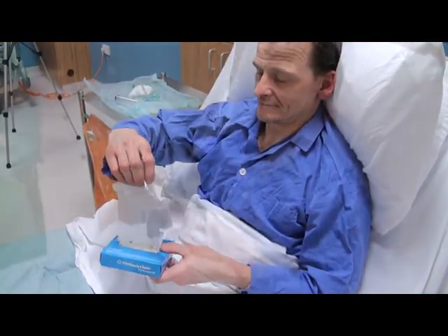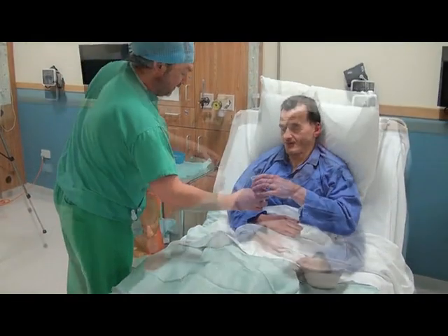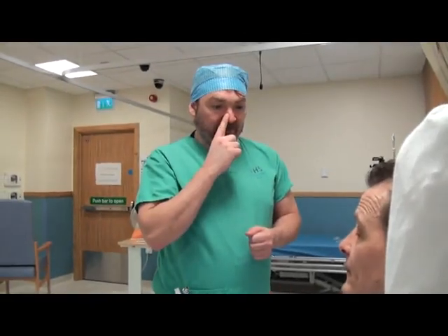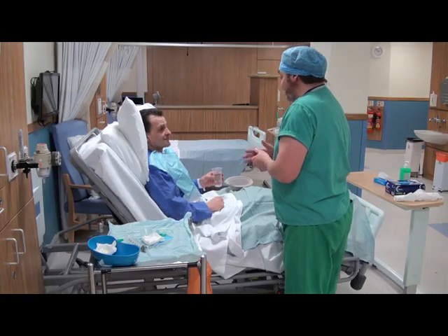Ask the patient to clean their nose in order to assess the patency of the nostrils. Patients can gag when the tube reaches the pharynx, so have some water at hand. Identify the most suitable nostril through which to pass the tube; when preparing the patient, it is important to choose the wider nostril.